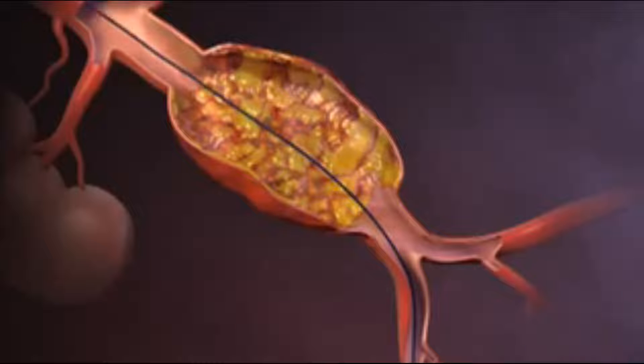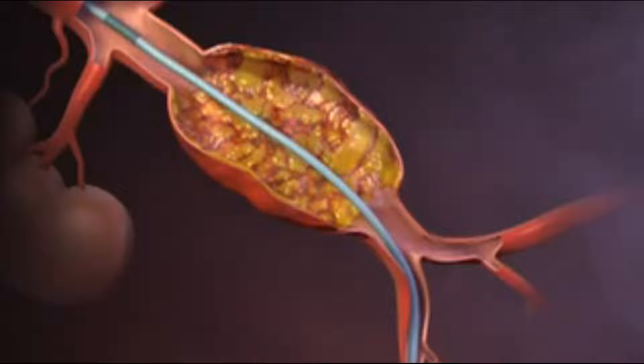a guide wire is introduced into the abdominal aorta through a femoral artery. This is followed by the sheathed main body of the stent graft, which is positioned with the use of fluoroscopy.